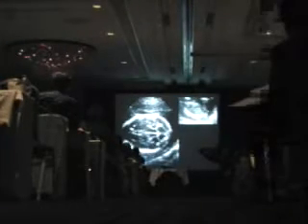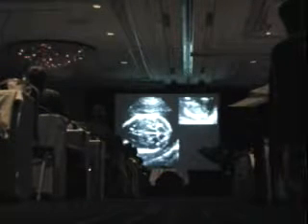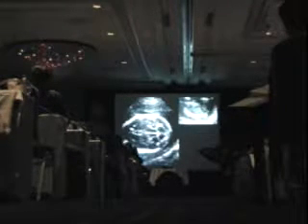But it is very easy to overlook those, particularly if the fetus is not in a good position. Now, this was a patient that we saw, had a new sonographer. This was years ago. A new sonographer on her first day brought me this case to review before I went in to check it. And this was her BPD.